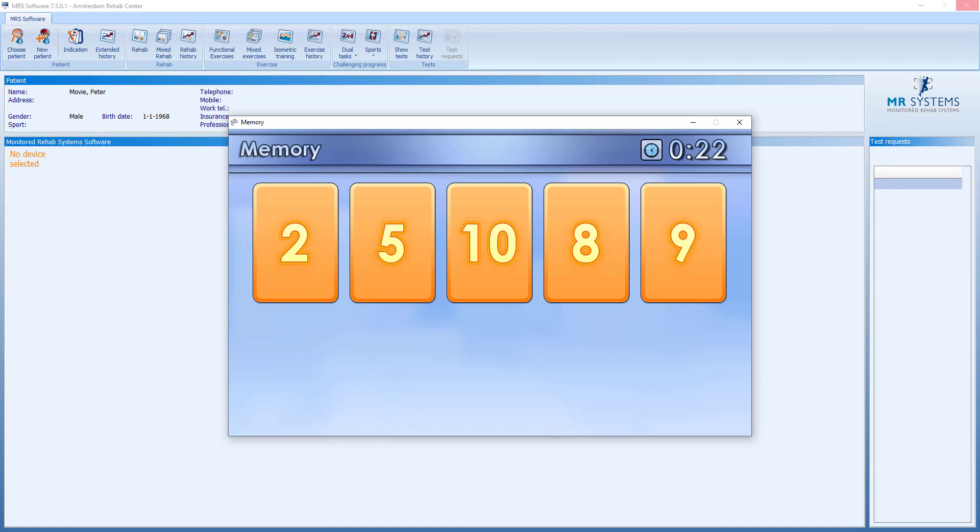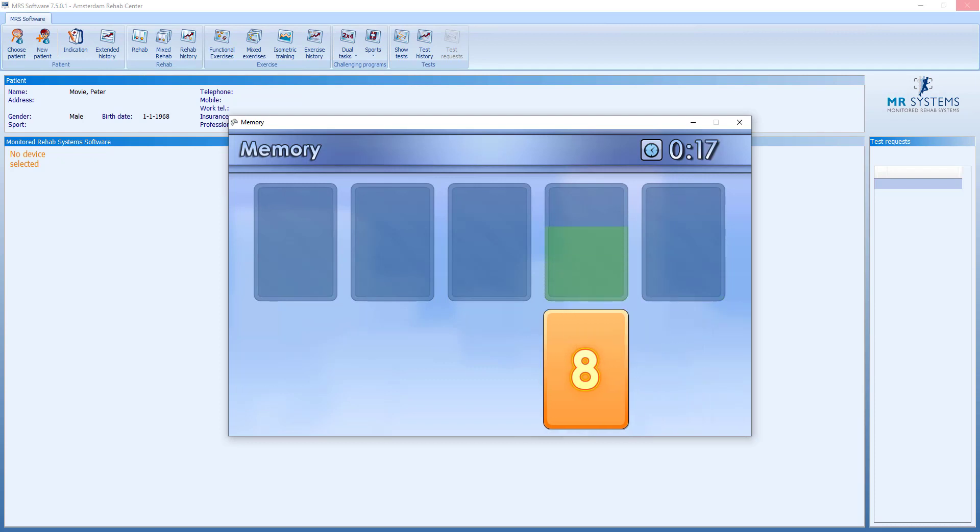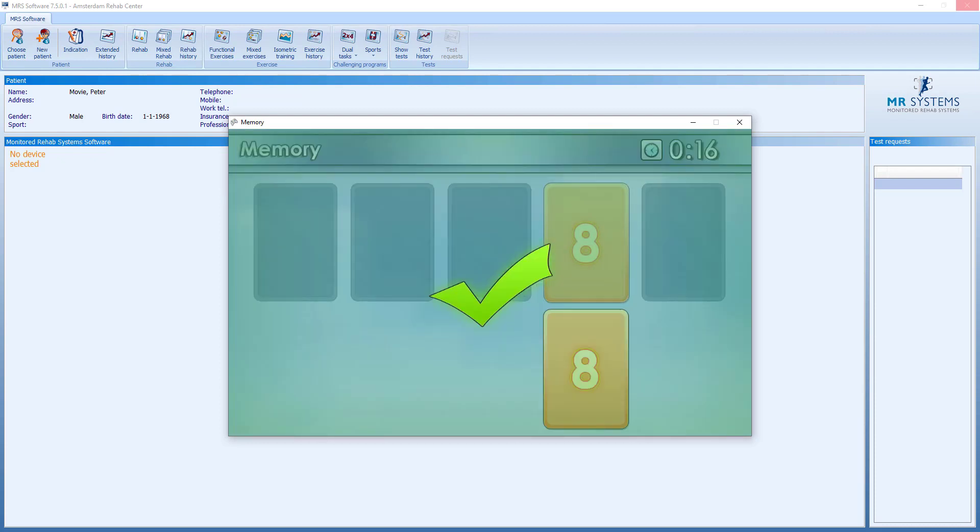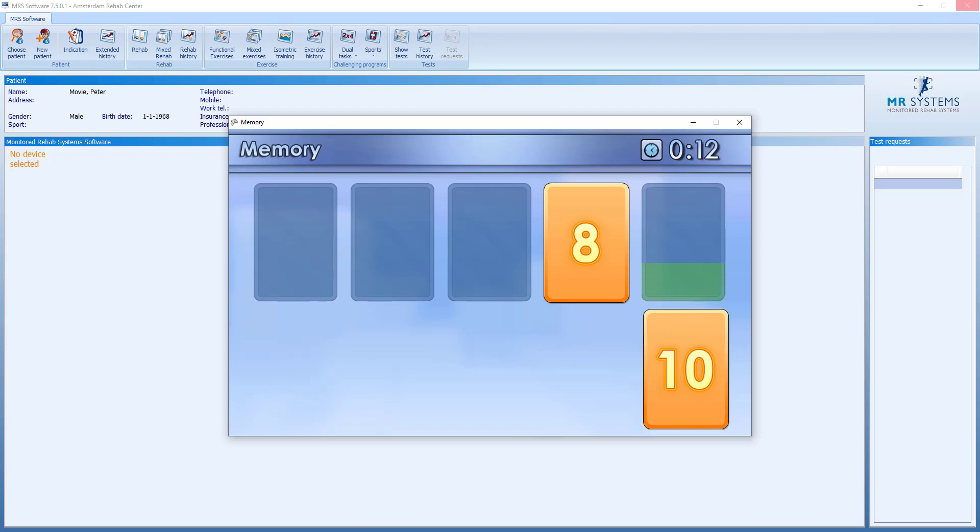Try to remember the numbers. Try to match where the numbers were.